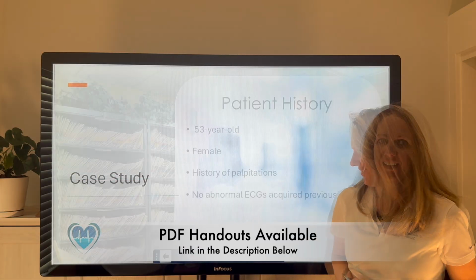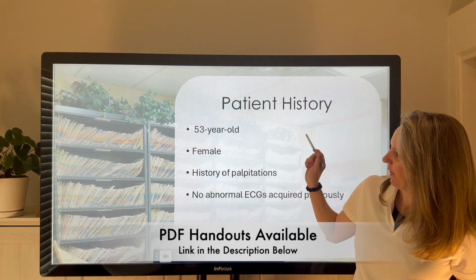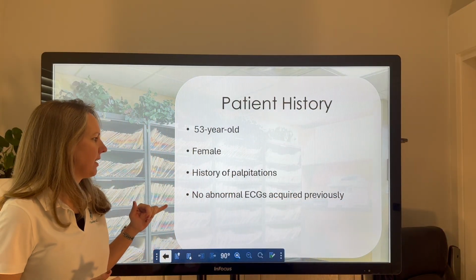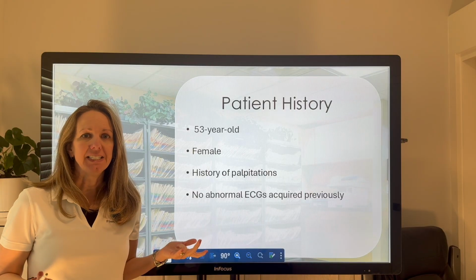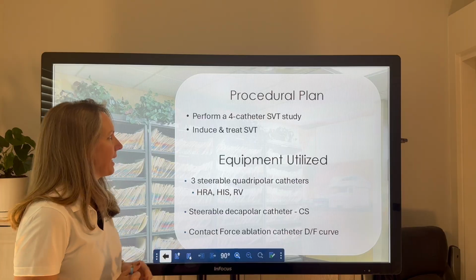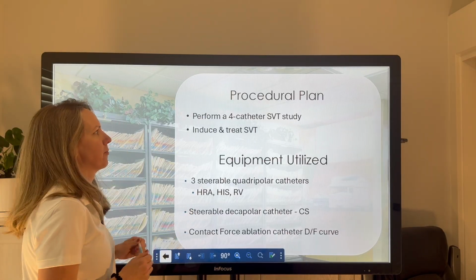Let's begin. Today's case study, we're going over a 53-year-old female, history of palpitations, and no abnormal ECG was acquired. So could kind of be anything. We don't have a whole lot of information there.